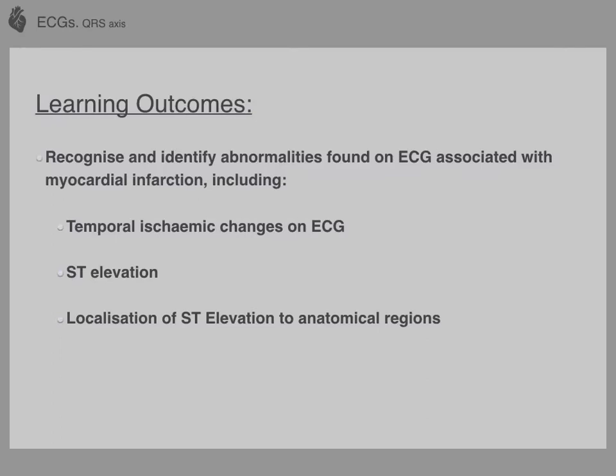So that's it for now. So hopefully you now feel a bit more comfortable recognising and identifying abnormalities found on an ECG that are associated with acute myocardial infarction, particularly those of ST elevation.